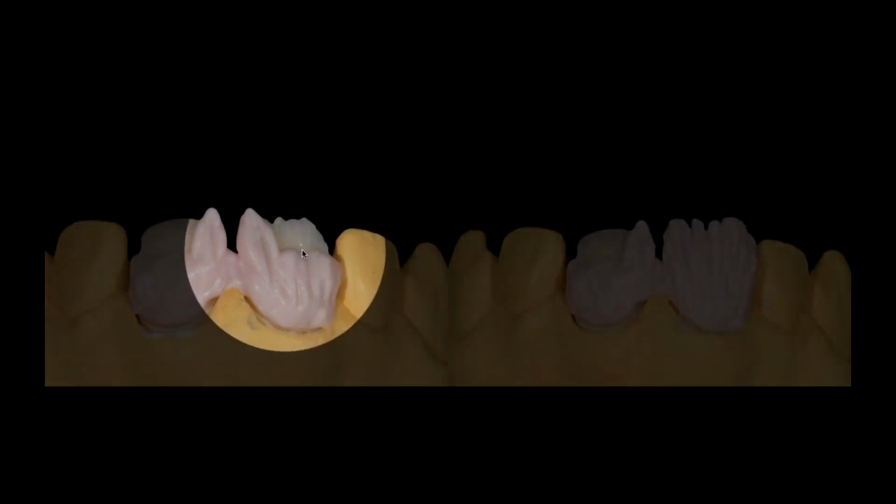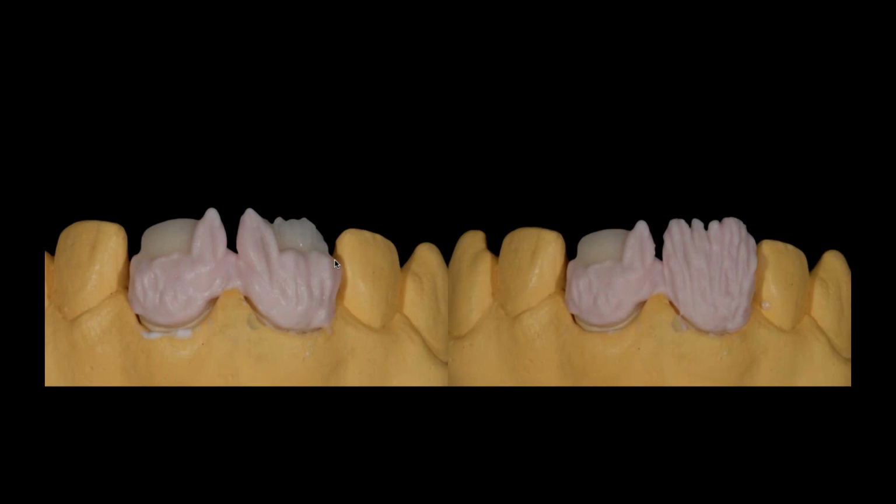The tooth next to it, I've already built it with opacious dentin. I've used 4 different opacious dentins, which means now I'm only going to have about 0.6 of a millimeter to actually use my dentin with. So it's going to change the concept of the dentin a little bit. But I wanted to prove the point to you of how valuable it is to understand that opacity and how well it works for you.